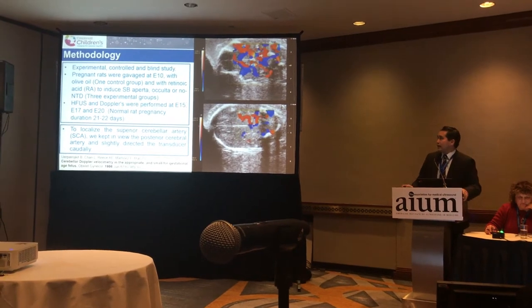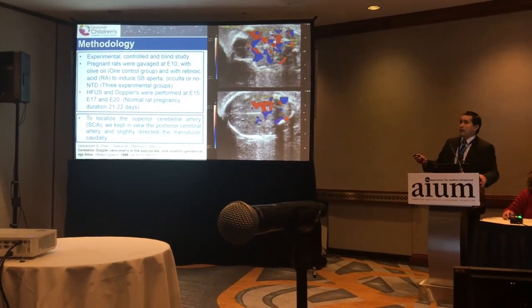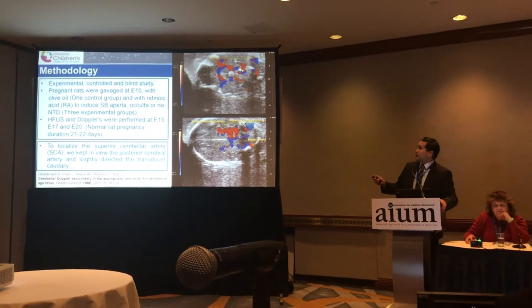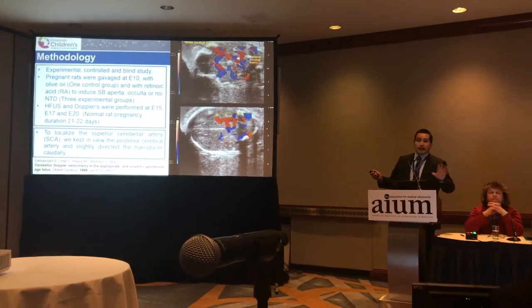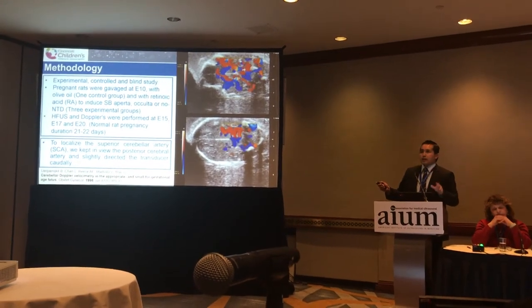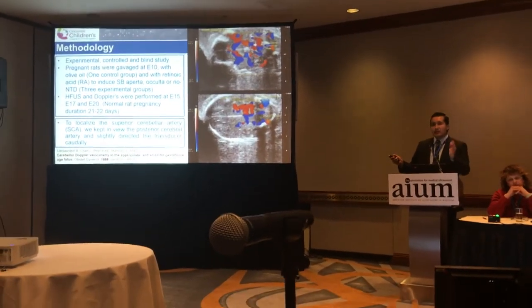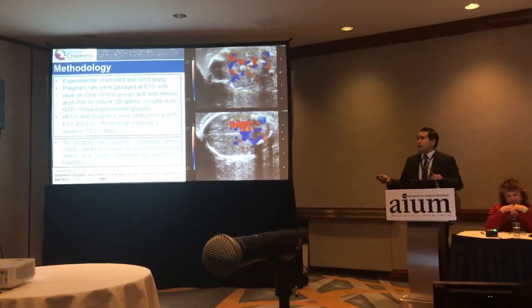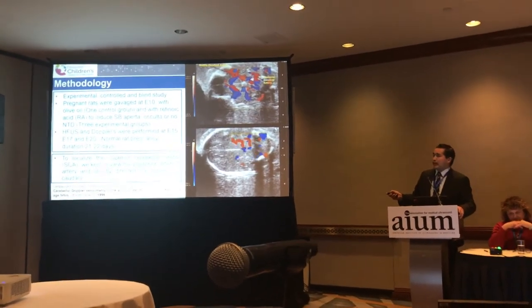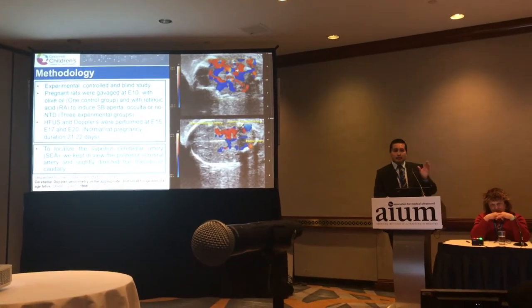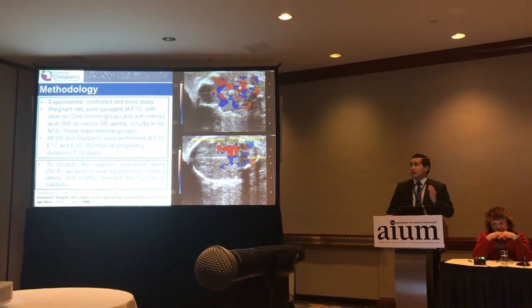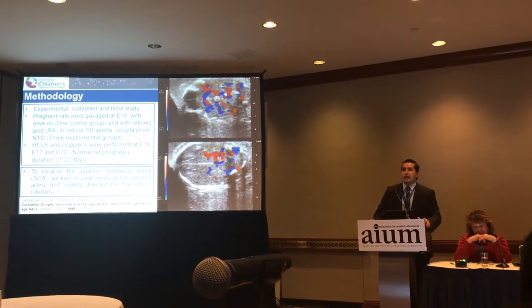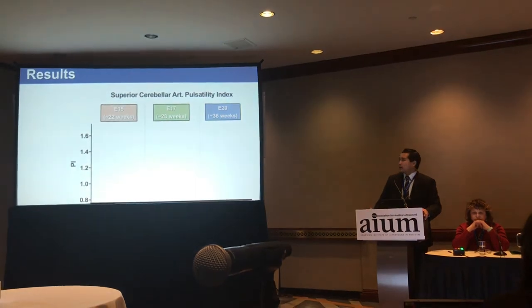We used his approach in order to identify this artery. First, we localized the circle of Willis, and instead of paying attention to the middle cerebral artery as we usually do, we paid attention to the posterior cerebral artery, another part of the circle of Willis. Once there, we tilted the transducer a little bit caudally to identify the superior cerebellar artery, which arises from the basilar artery and runs parallel and posterior to the posterior cerebral artery. We should note that the cerebellum receives its oxygenation through three main arteries: the superior cerebellar artery, which is identifiable by ultrasound, and two inferior cerebellar arteries that are not easily identifiable by ultrasound.